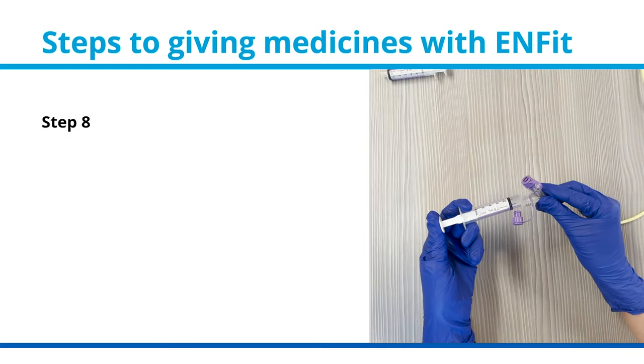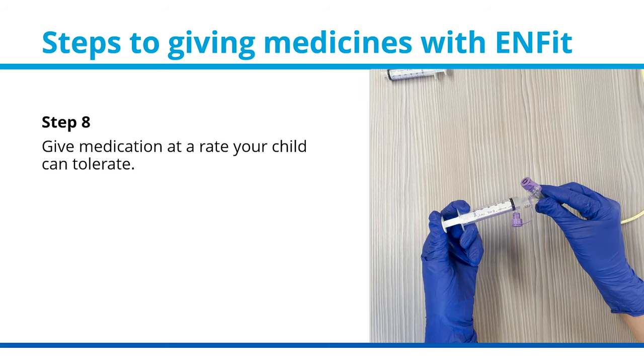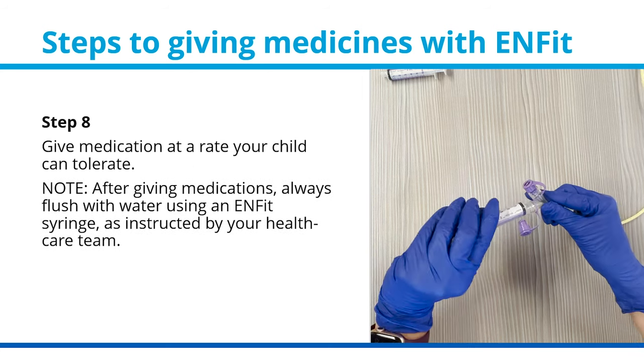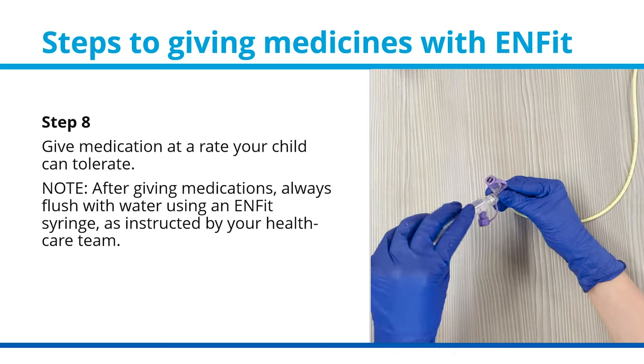Step 8: Give medication at a rate your child can tolerate. Note: after giving medications, always flush with water using an ENFIT syringe, as instructed by your health care team.